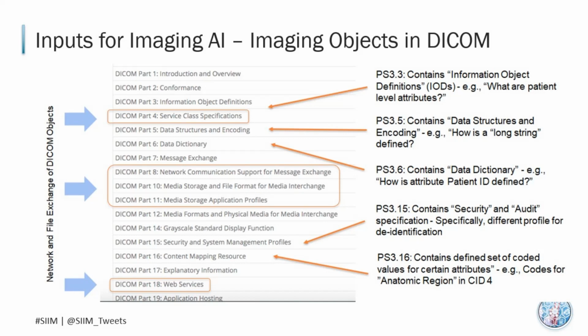Last but not least, there are different parts that focus on communications, whether it is using the traditional DICOM binary protocol, the newer DICOM web using HTTP, or from media. The good news is that there are many open source or commercial DICOM toolkits that can really help you working with DICOM. I'm pretty sure you have already had some good experience in your previous prototyping.